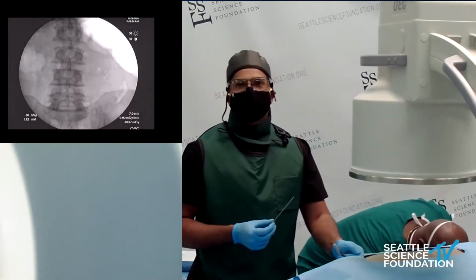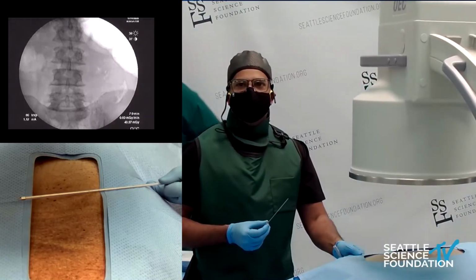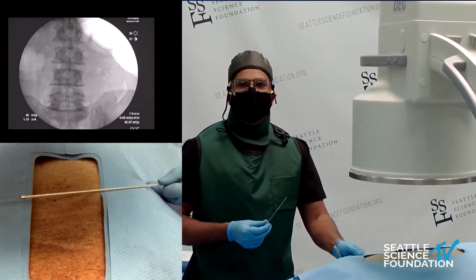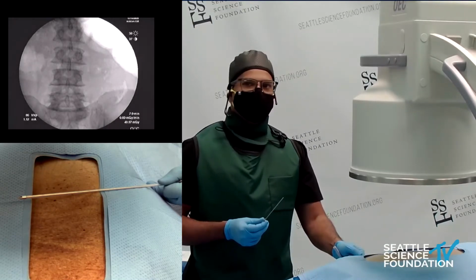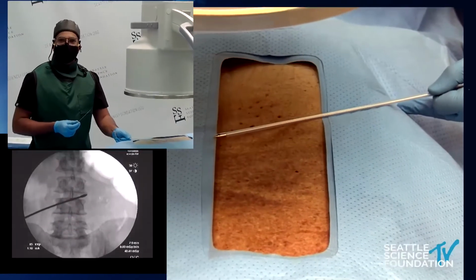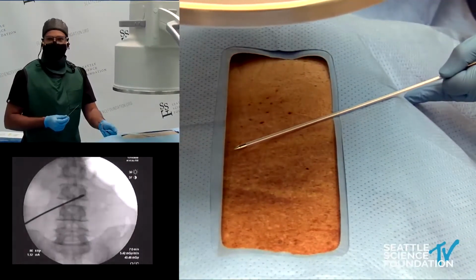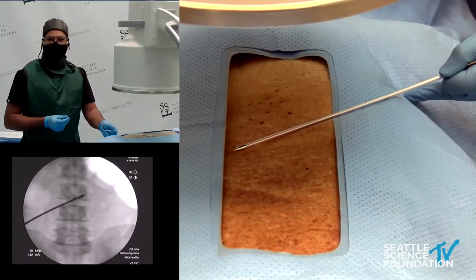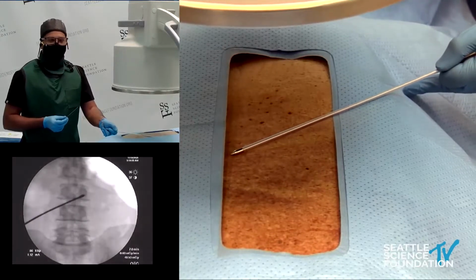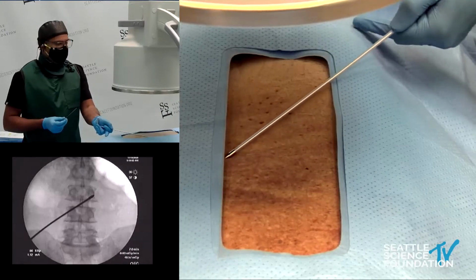And what Justin has nicely done here is that he has lined up the superior end plate of L3. He has the spinous processes basically in the midline. And so what we're going to look for here is, this is our target pedicle right here, right L3, okay? And then we're going to draw a line through that 3-4 interlaminar space.